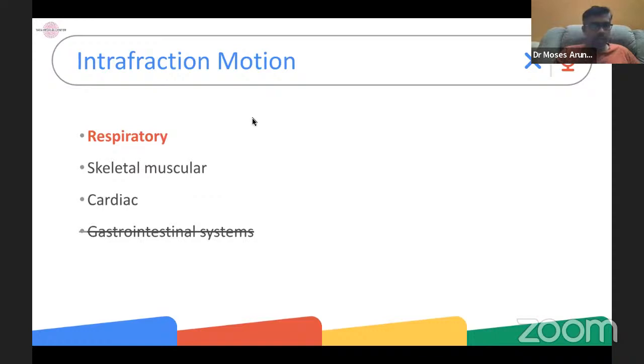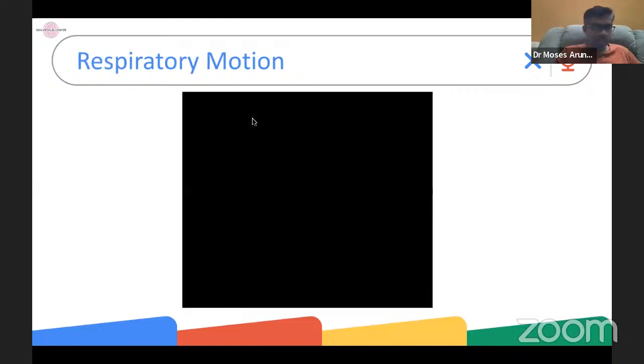When we talk about lung SBRT, because there are going to be long treatments, we have to think of immobilization procedures which are comfortable for patients. There's no clear evidence that any one immobilization method is superior to another, or even that strict immobilization is needed for lung SBRT, as long as you have robust imaging and image guidance algorithms available to correct any errors that come up.